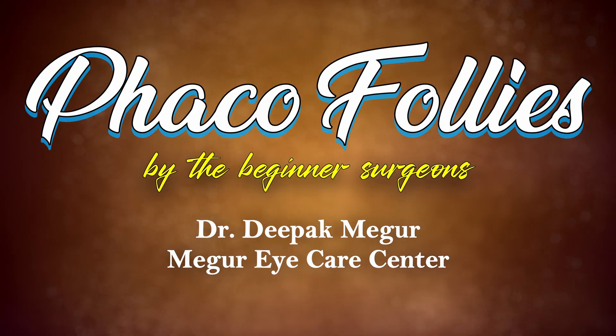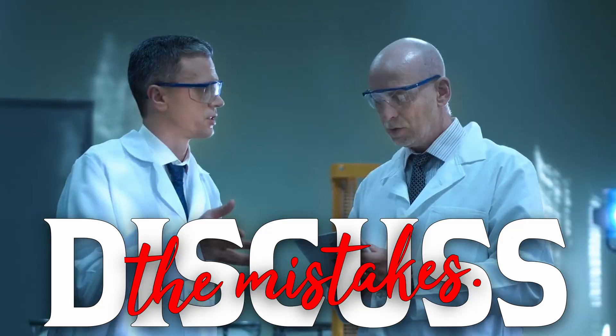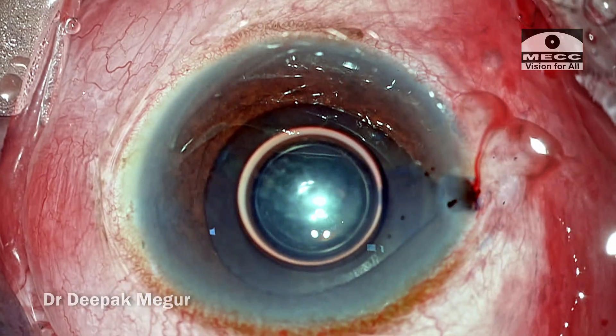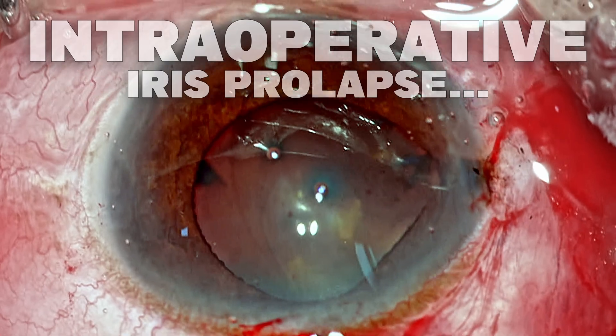This is a new series which I am starting, aimed at analyzing a few of the common errors done by the beginner phaco surgeon. In this case, I will be discussing the most common mistakes done by the beginner surgeon which would result in an intraoperative iris prolapse.